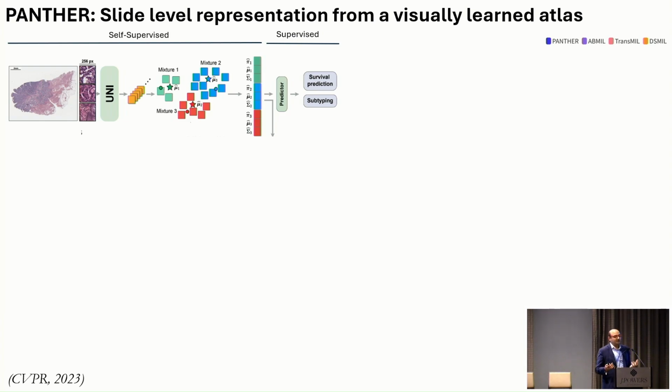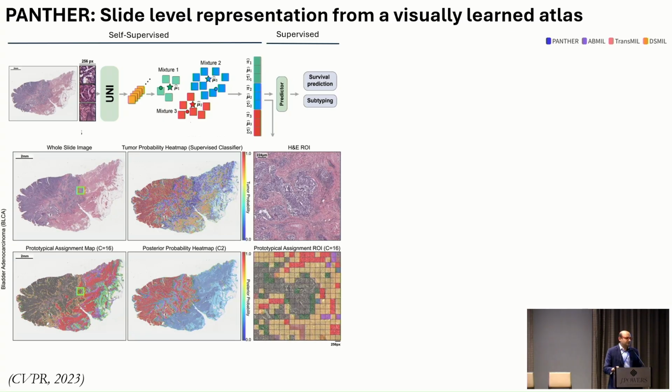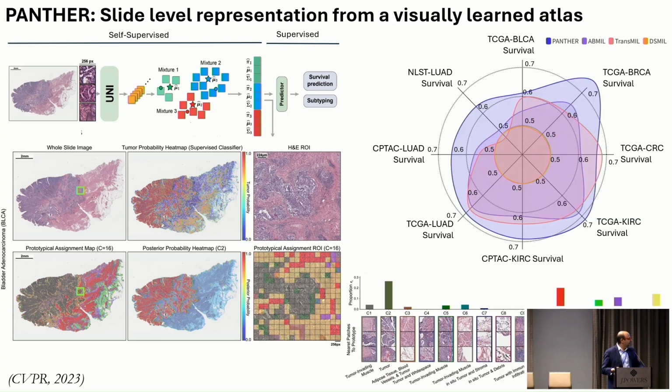So once we had these kind of models working at our region within the slide, the obvious next step was, can we scale this to the entire slide? So we started by looking at very fundamental methods. Can we just use really a mixture of experts, other kinds of really fundamental methods to see, can we build a slide level representation of the entire model. So that's how we started, by looking at this.